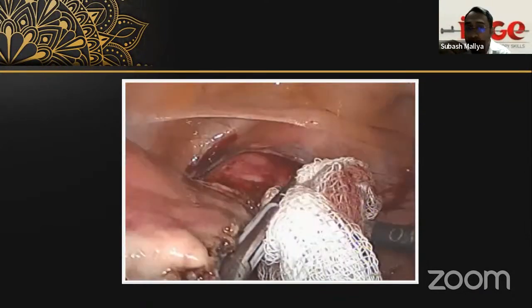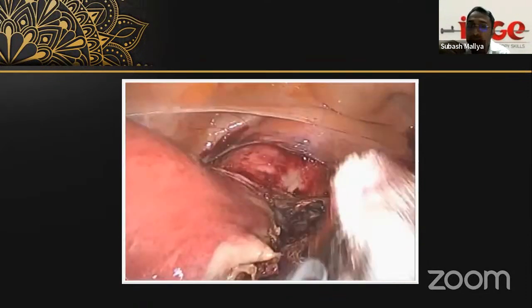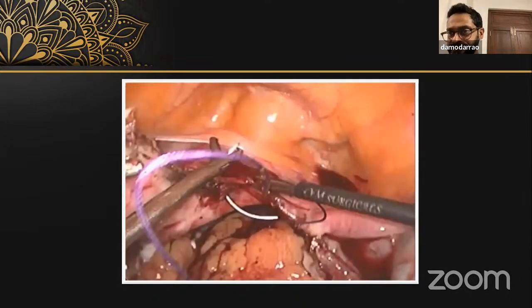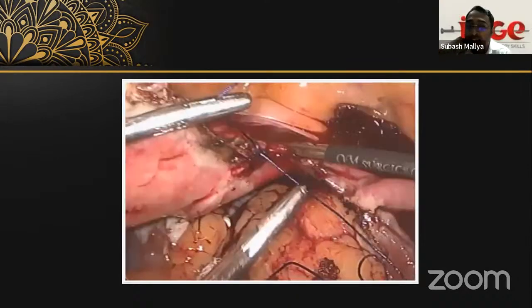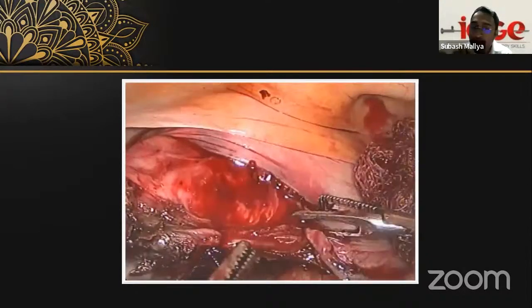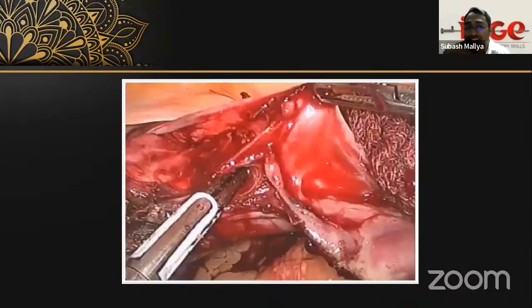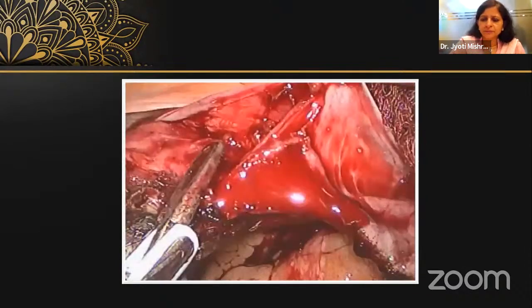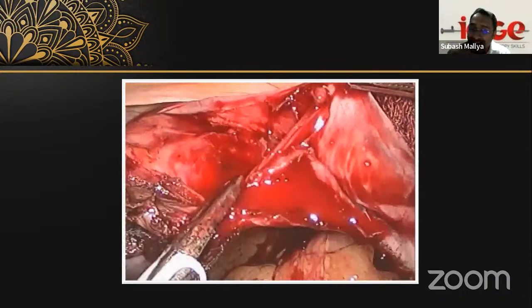Secondly, what we see here is probably the bladder pillar area. And now I've taken a stitch here because it was not stopping. You see, sometimes you don't learn from your mistakes, and that is very wrong. Again, I'm proceeding ahead without even pushing the bladder pillar down. I refuse to learn from my mistakes, and that is where I may have done it again.